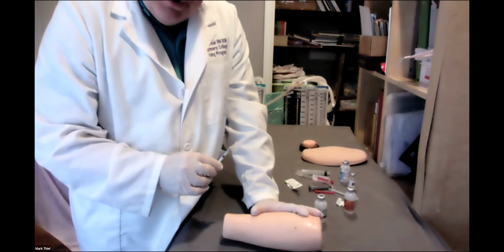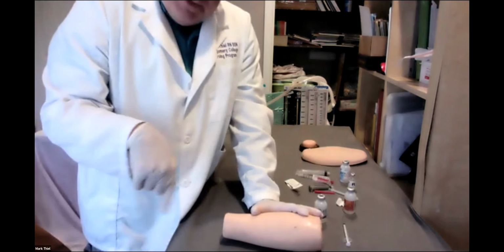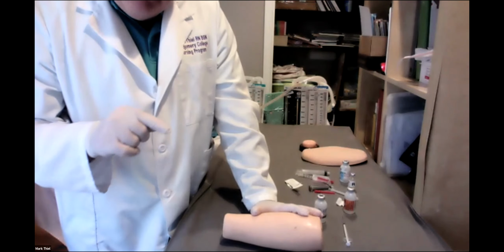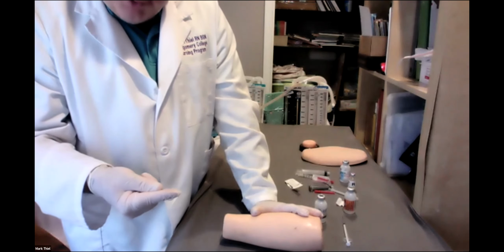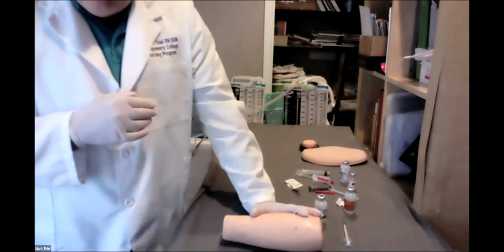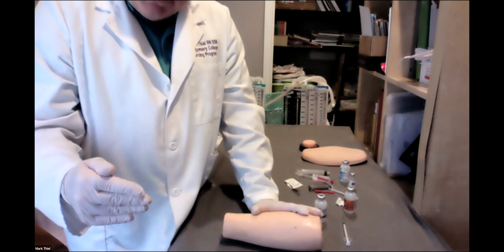Withdraw your needle. Now it's in a circular pattern. The key here is our nursing actions. It must be read 48 hours to 72 hours, not before, not after. If you do go after, you will have to repeat it after 72 hours.